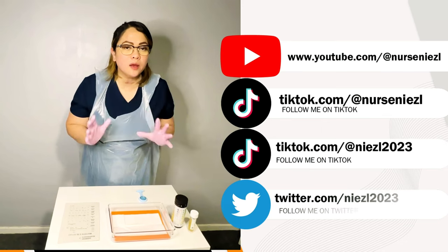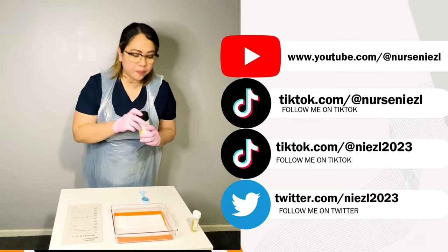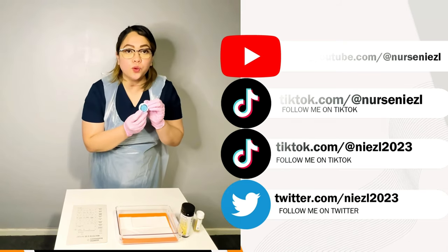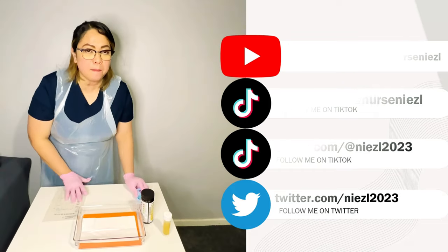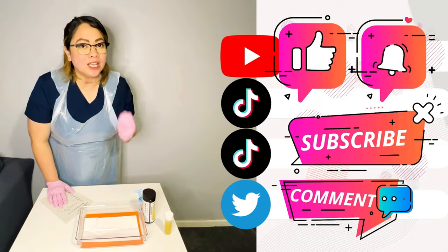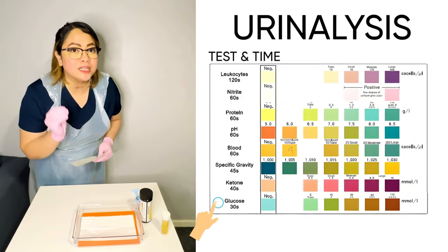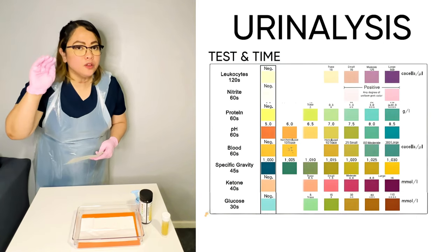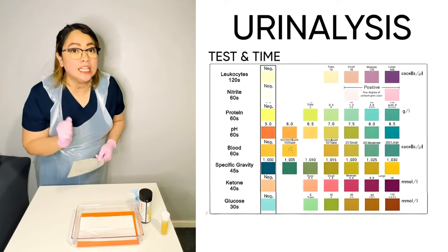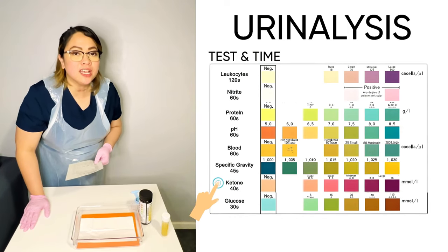Nurses, before I start, let me just tell you that once you dip the strip into the urine, that's the start of your time, okay? Remember, when you're doing the urinalysis, the reading should be done on a specific time. If you have to check for glucose after 30 seconds, yeah? As the time continues, when it gets to 40 seconds already, you got to check the ketones. Once it gets to 45 seconds, you have to check for the specific gravity.